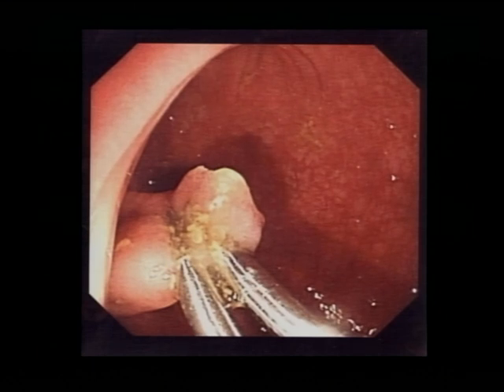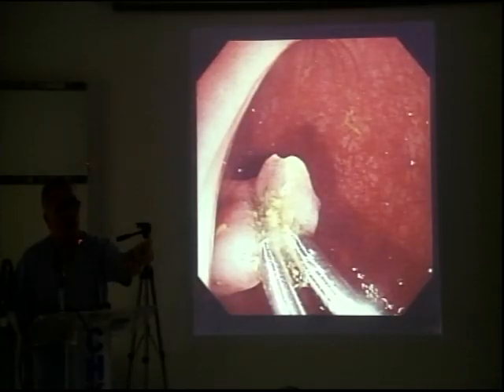And then the next bit is advance, so that means they open up. What you're not aware of is that there's a hook that holds the clip on, and it's been fired. When they advance and you say, right, release, they open it. What it shoots forward is a 3 centimeter piece of steel, this length, with a hook on the end. As they open it like this, it shoots straight out, and that can go into the mucosa, perforate and hook on, and then you're trapped. The same thing applies for the ones that open and close.